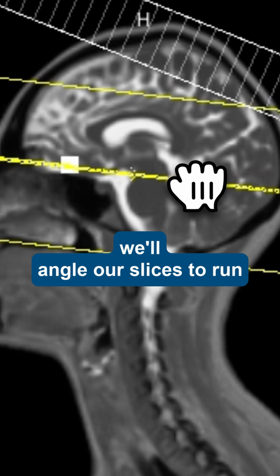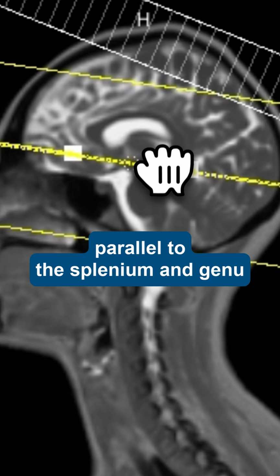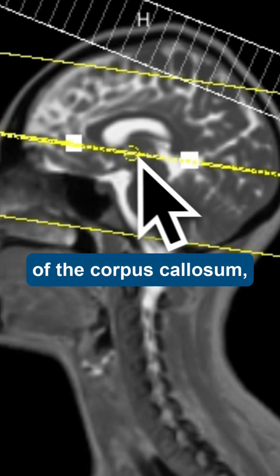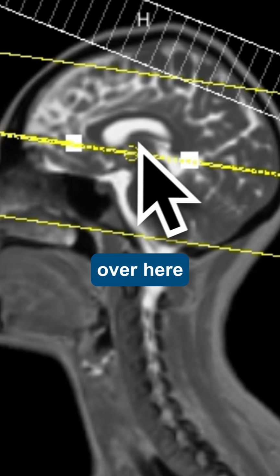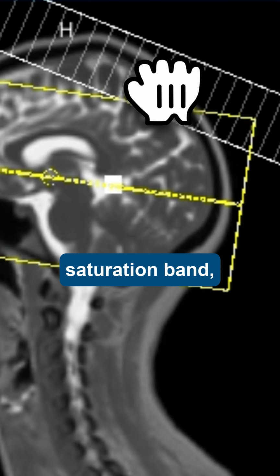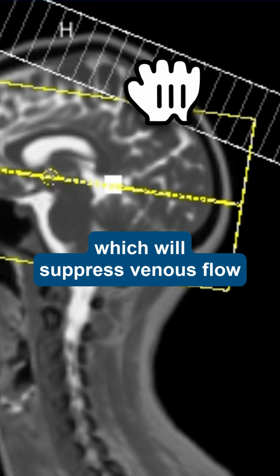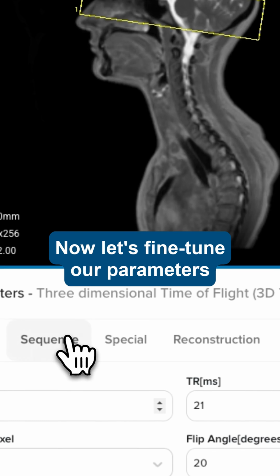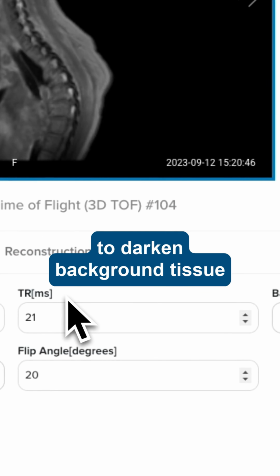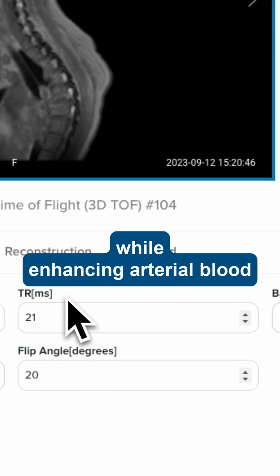Next, we'll angle our slices to run parallel to the splenium and genu of the corpus callosum, these 2 points shown over here. We can also add a superior saturation band, which will suppress venous flow and make the arterial blood stand out clearly. Now let's fine-tune our parameters to darken background tissue while enhancing arterial blood.